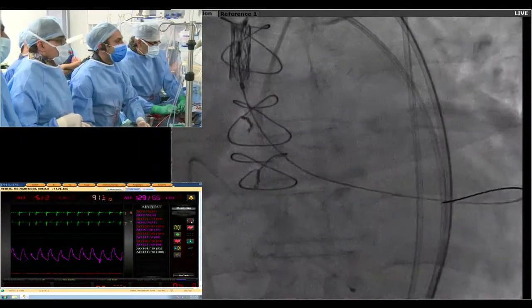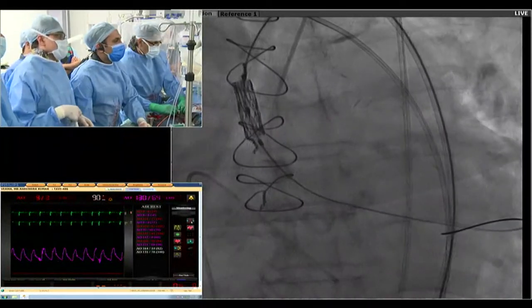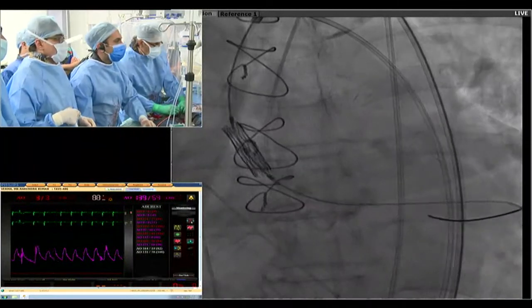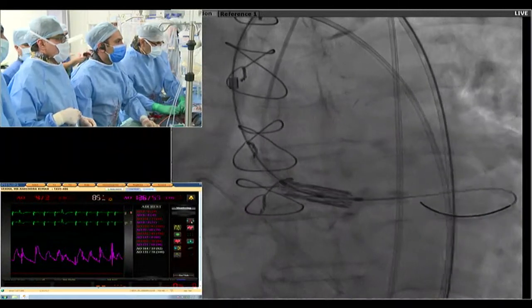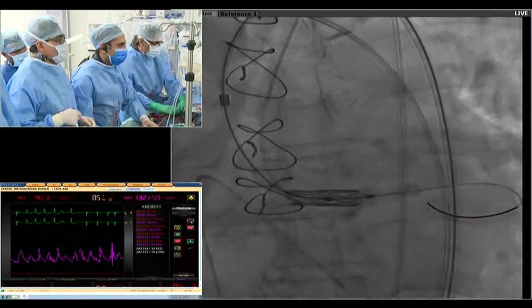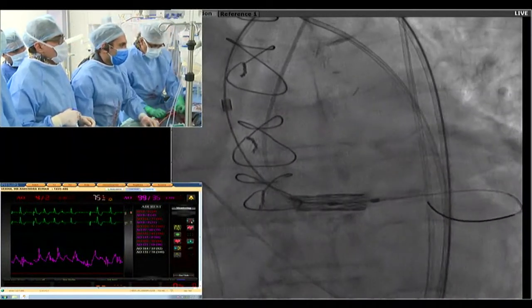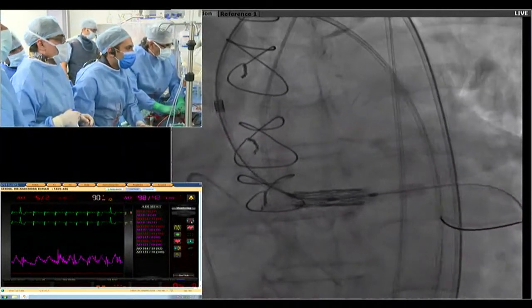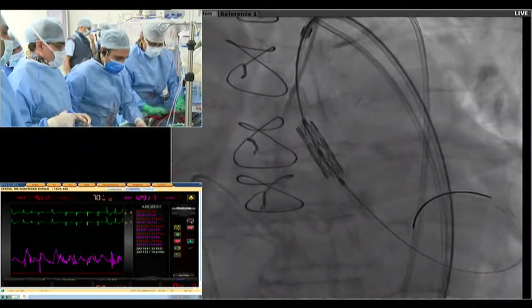So you can see how the entry into the left ventricle is so oblique. Let us see. Yeah, let's go and push it in. Let us see if we are able to enter the valve. Yeah, go ahead, push, good. Push more. See how horizontal it is, push. Okay, so we'll come back again. Hold there. We'll try to flex it more.